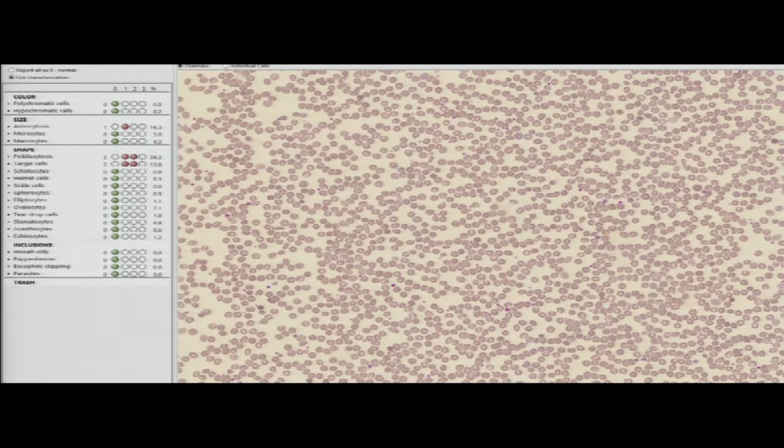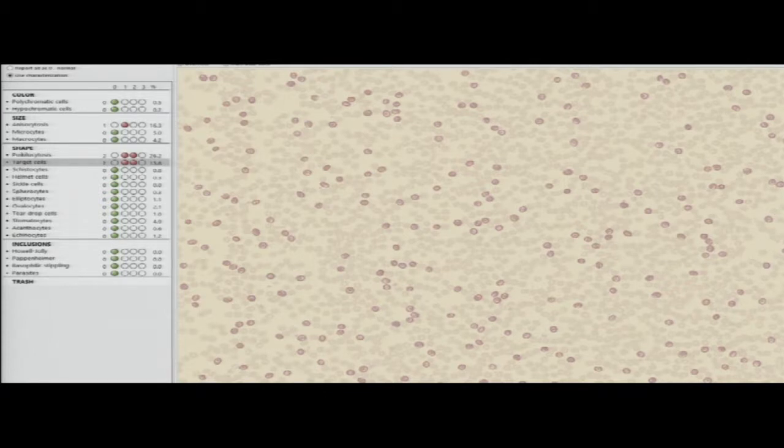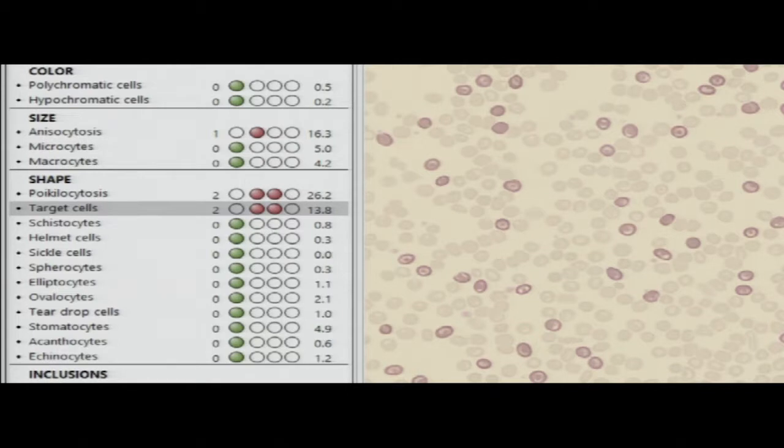Target cells — and you see target cells are highlighted. I just click on that and you get all the target cells, along with the percentage of target cells you are looking at. This will improve over time because you might see target cells in the background that are not shown up — some may be missed. Nevertheless, what is important is to know that we are in the right direction. And that case had an A2 of 5.4.